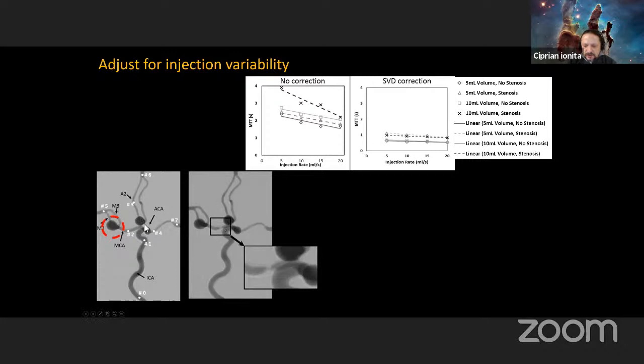Then he's going to conclude that the patient with a stenosis has the same kind of hemodynamics as a patient without stenosis, which is entirely different hemodynamics. Again, injection parameters or the hand injection are extremely important, and it will skew the data to the point that you cannot relate an angiogram from one center to another. Hence, we need to take care of this.